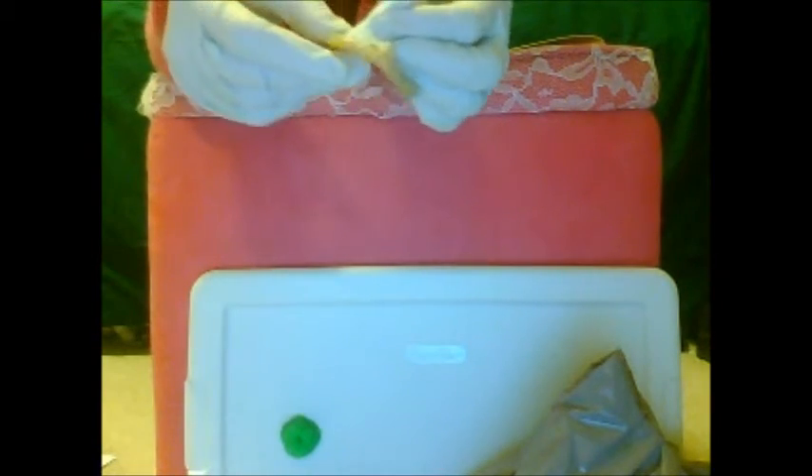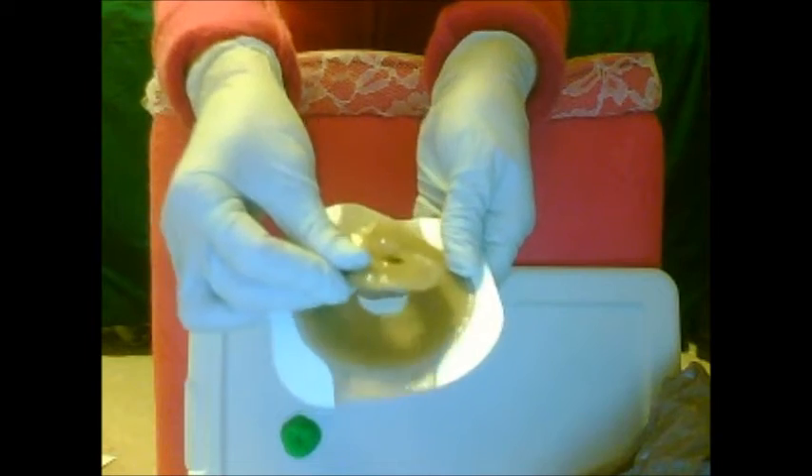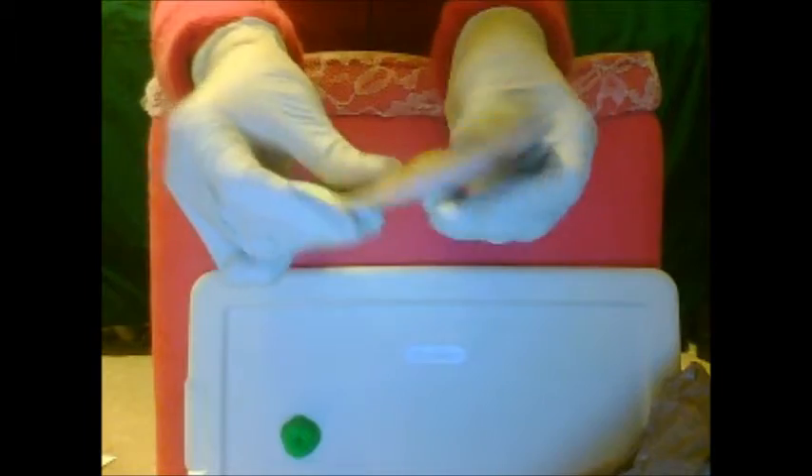Always wear gloves — except sometimes when putting on this ring, and then just put on a different pair of gloves because it'll stick like crazy. Pull off the backing — that's all adhesive there. It won't kill you. Set that right on there and press it down.